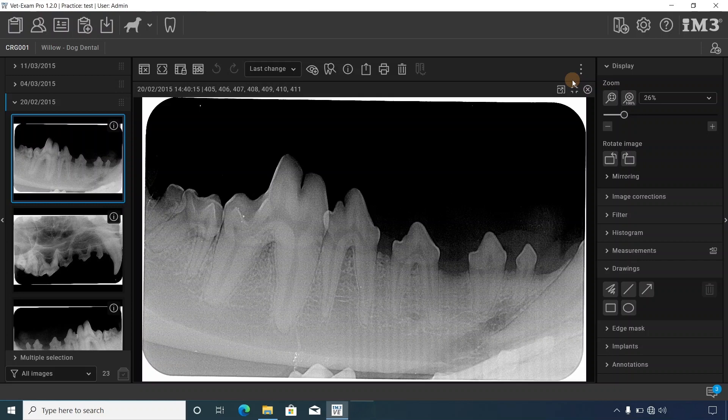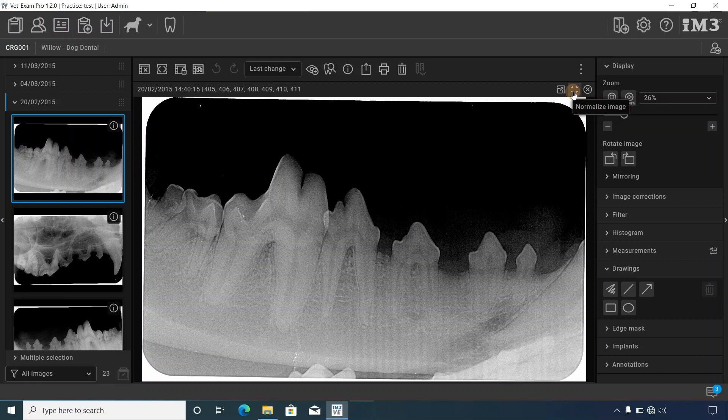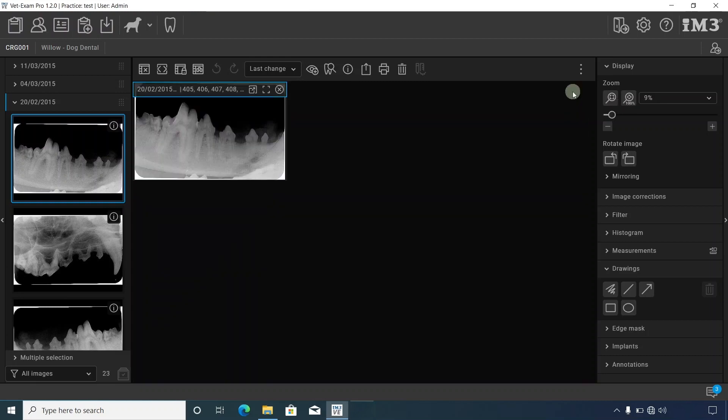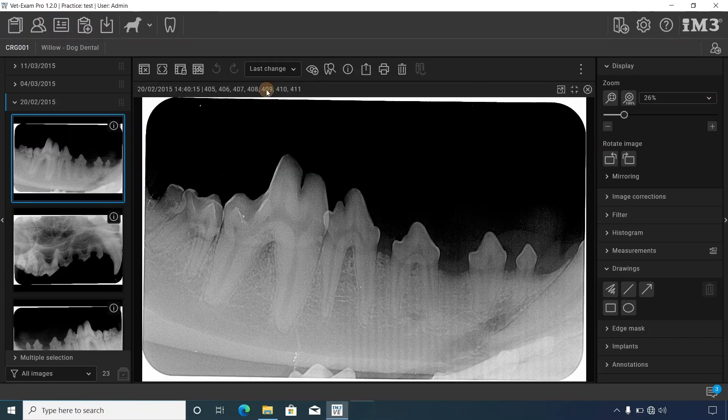To edit and make changes to your images, use the toolbox. After dragging and dropping your image into the viewer, click the normalize image icon to normalize the image, or click the maximize image icon to maximize it.